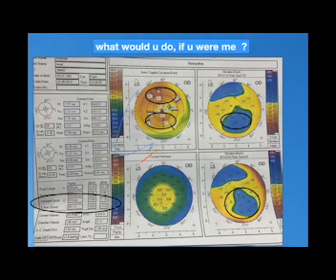I want to emphasize it. The thinnest location Y coordinate is minus 1.2, but still away from the Kmax. The Kmax is plus 3.02. It's shifted up. The Kmax is so superior. It's totally away from the thinnest location. Yes, it would be more suspicious, and more guiding, if you found the Kmax at, close to, near or around the thinnest location deviation. Okay.